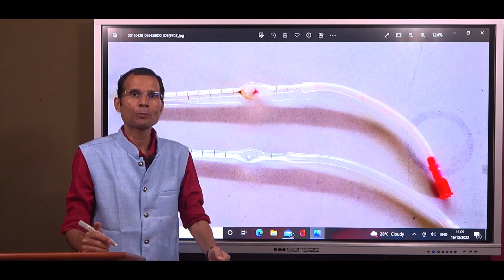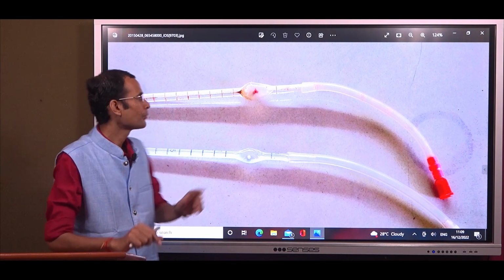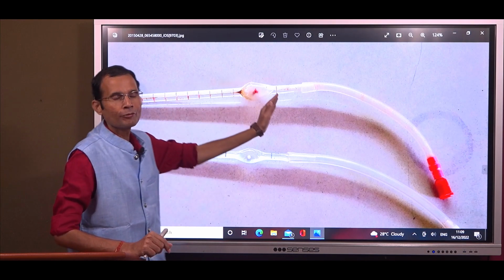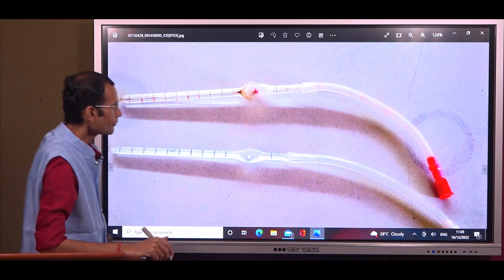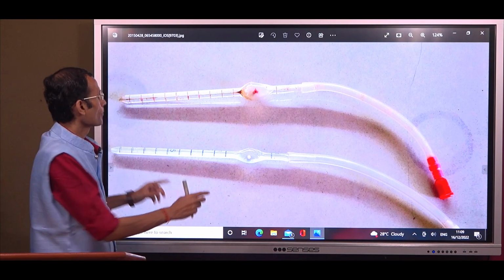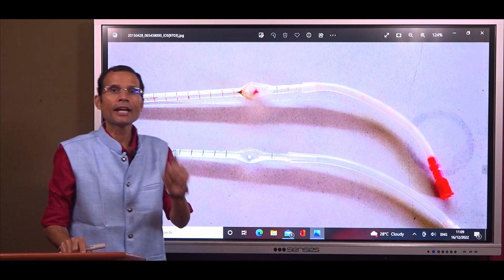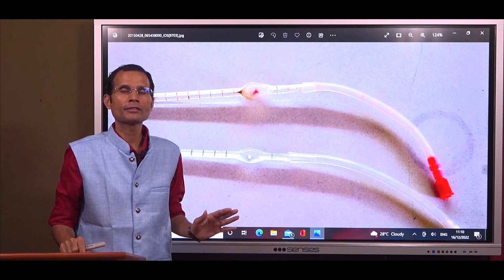And then remember, when you are going to use that mixture, don't forget to discard the first 1 or 2 drops. Because you know what has happened? The blood sample has gone into the bulb entirely, and the diluting fluid has also gone there, and mixing happens over there. That means the stem portion will contain only the diluting fluid, no blood, no cells.